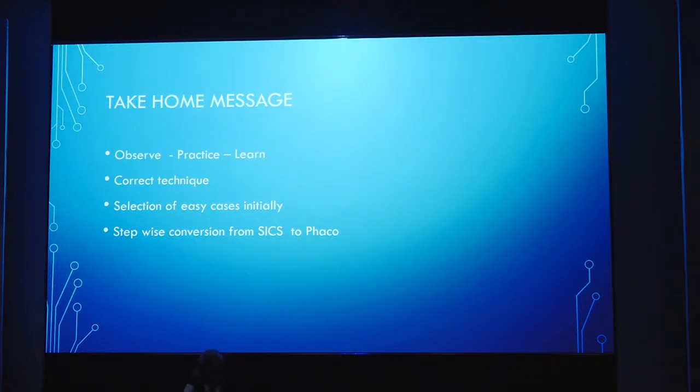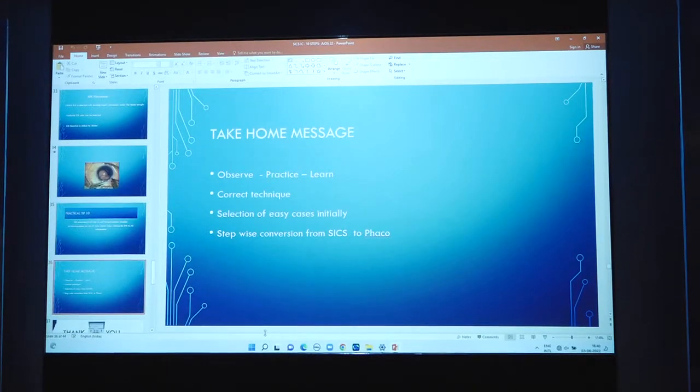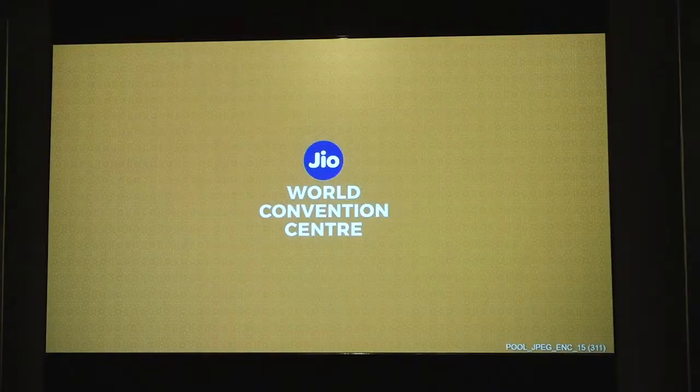No, sir. Conjunctival flap, we cut at the limbus. So it is a fornix based flap. If we take some part of the conjunctiva behind the limbus, it can cover the wound. So it is easier to reposit it. Yes, that's true. We can cover the wound. Yes, sir. So that's a good tip, sir.